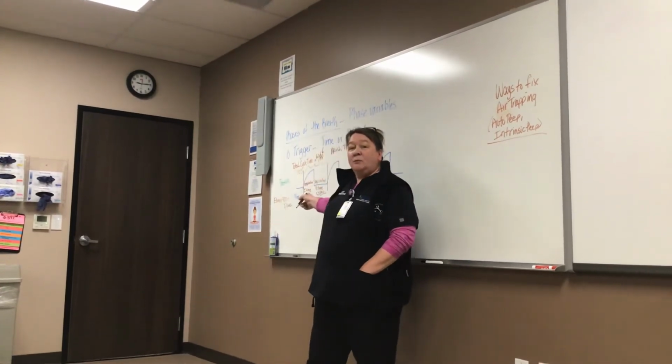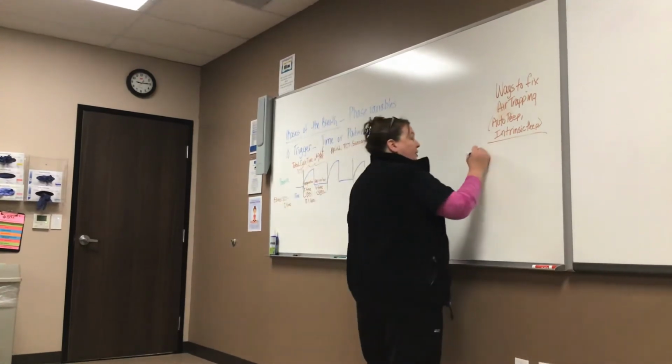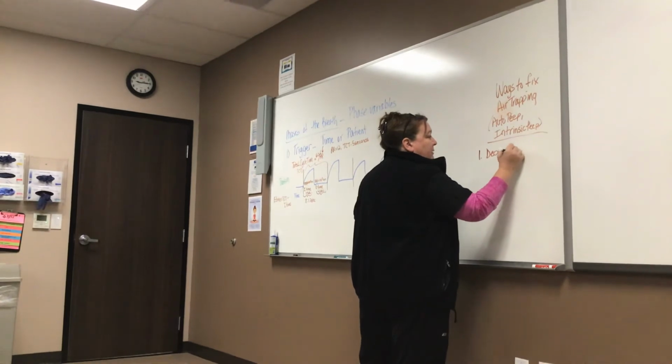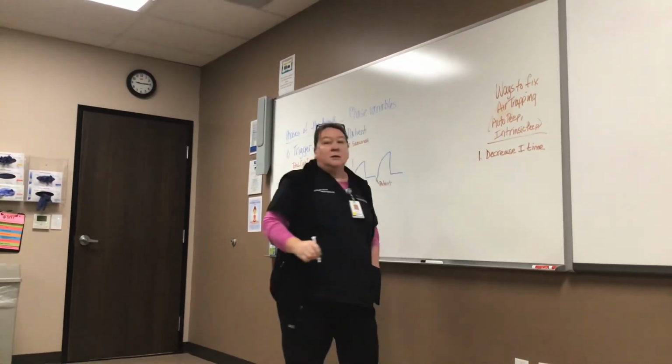So what did we just learn? One way to do that: decrease the I time. So drop your I time. So decrease the I time, or increase the TCT.